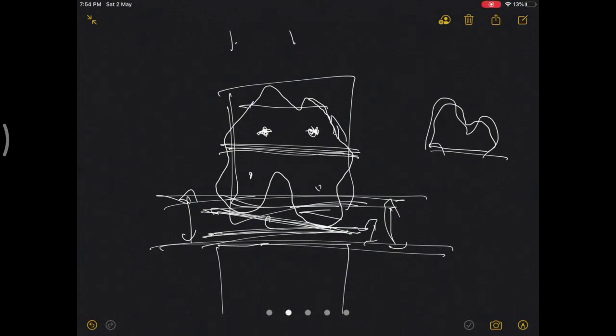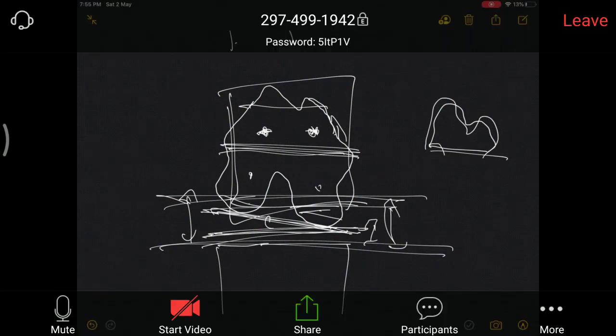Why this is important is, sometimes in cases of revisions, you don't have these many landmarks. You will not have condyles to abut the sizer, and in cases of valgus deformities, you may have a hypoplastic lateral condyle. So you'll have to keep all these things in mind before deciding the component rotation.